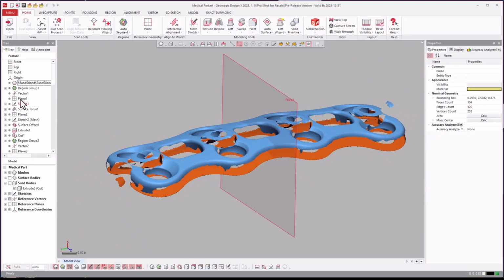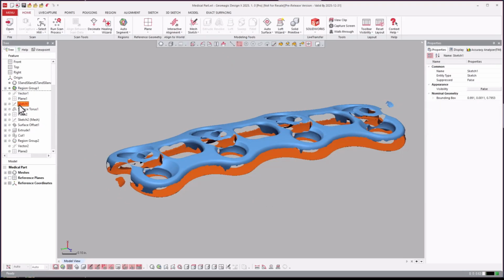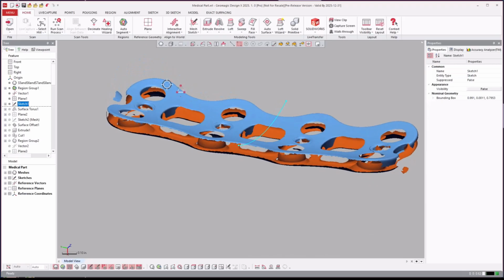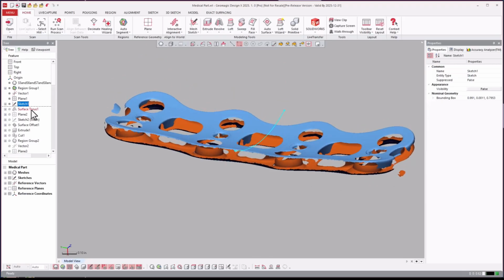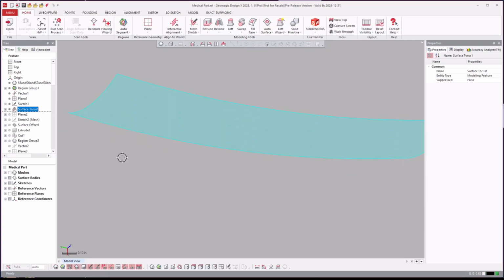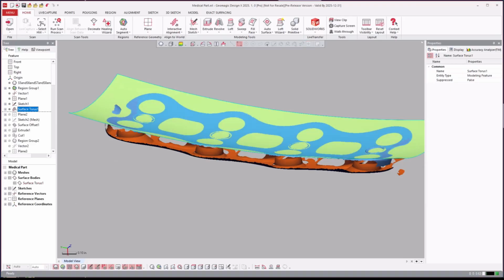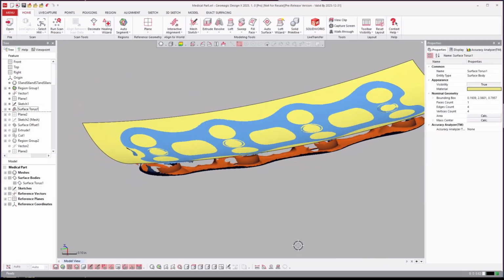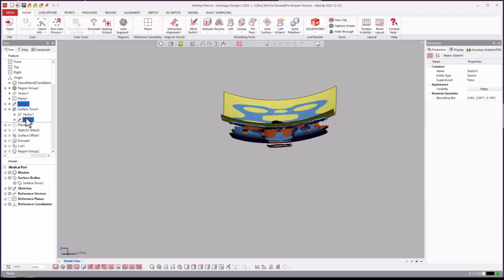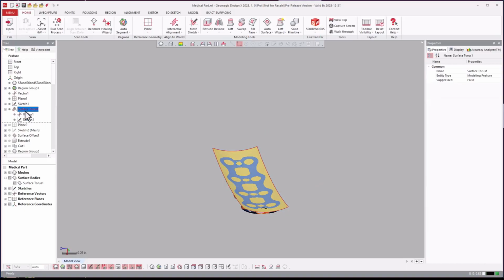So we can go ahead and just roll back and take a gander and see how they went about doing this. But this is really neat just to show the fact that we went ahead and modeled this medical part, using it for medical applications. So we'll go ahead and you see there that we were able to just turn on the surfaces there and rotate that around, and we'll come over to that. You see there that we just went ahead and rotated that about, so that is a surface.